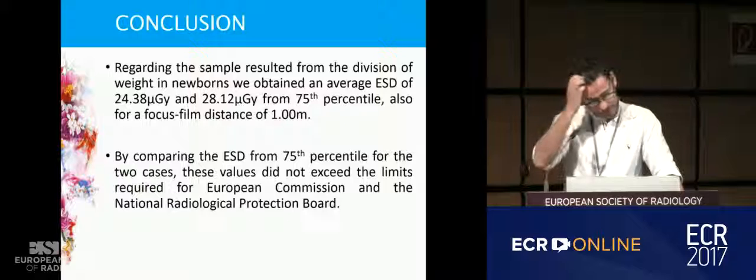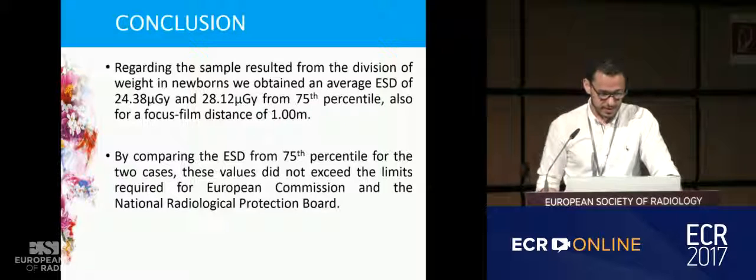We compared the results from the 2 cases, and these values did not exceed the limits required by the European Commission. There was one paper where we had a slightly higher dose, but it was by a small margin. So this study was composed of around 200 radiographs, and we hope to expand it further in the future.